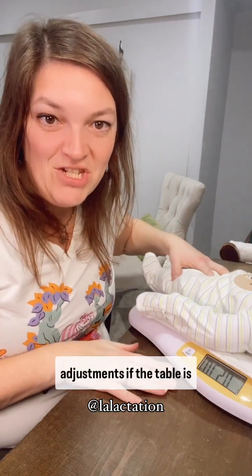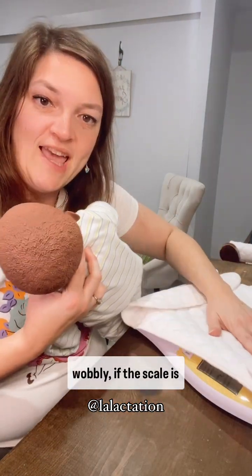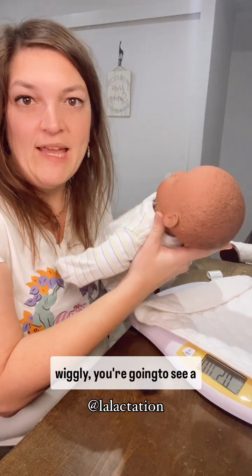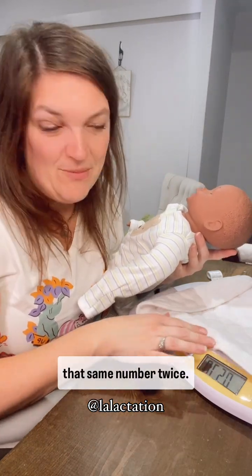Now, if there's any adjustments — if the table is wobbly, if the scale is wiggly, if the baby's super wiggly — you're going to see a different number. You want to make sure you get that same number twice.